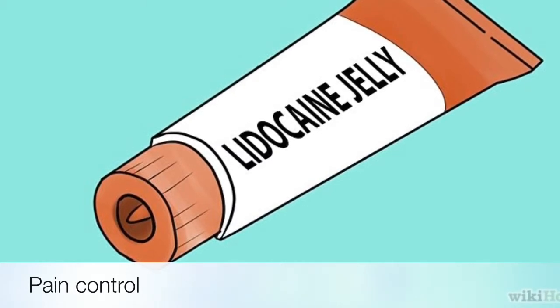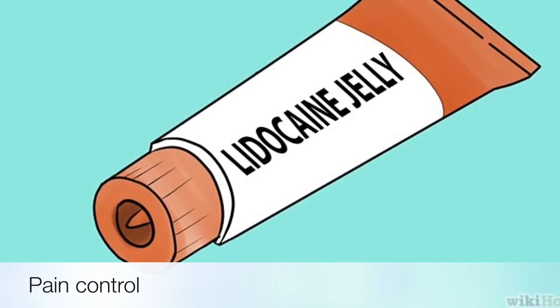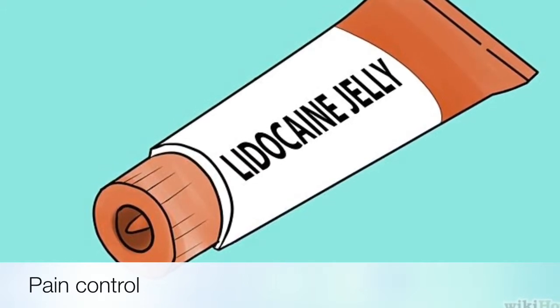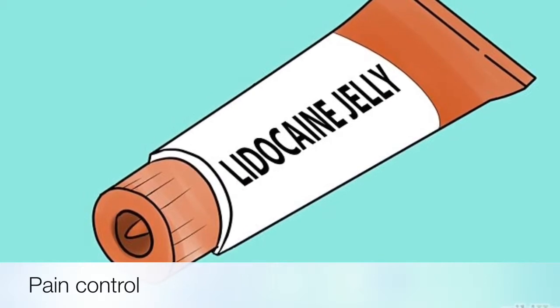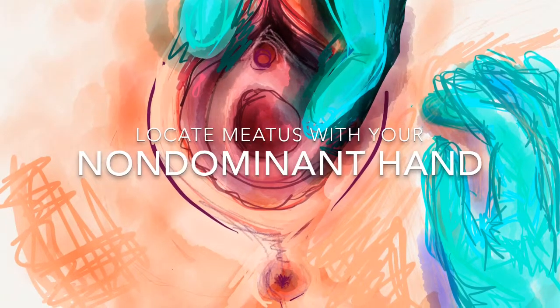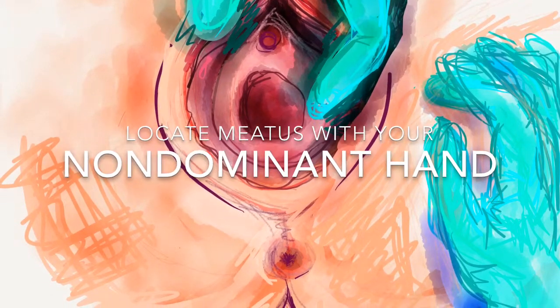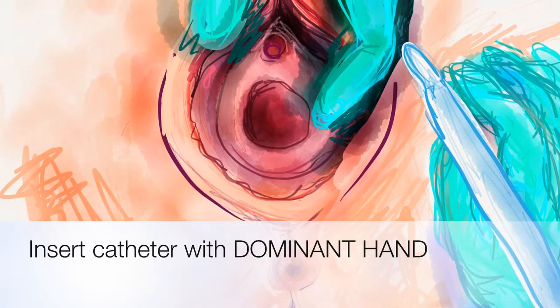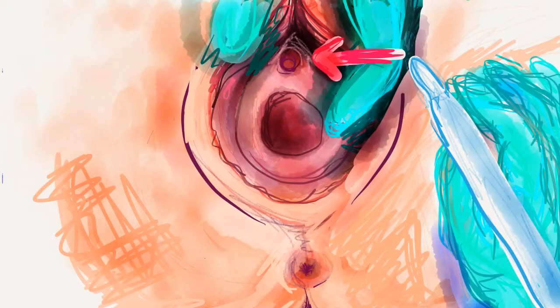If anesthetic jelly is to be used, now would be the proper time to insert the lubricant into the urethra with a syringe. You may instead choose to cover the tip of the catheter with the lubricating jelly rather than physically injecting it. With your dominant and still sterile hand, take the catheter and insert into the urethral meatus. Advance approximately 3 inches. Wait to see if urine flows, and then advance another inch before inflating the balloon.